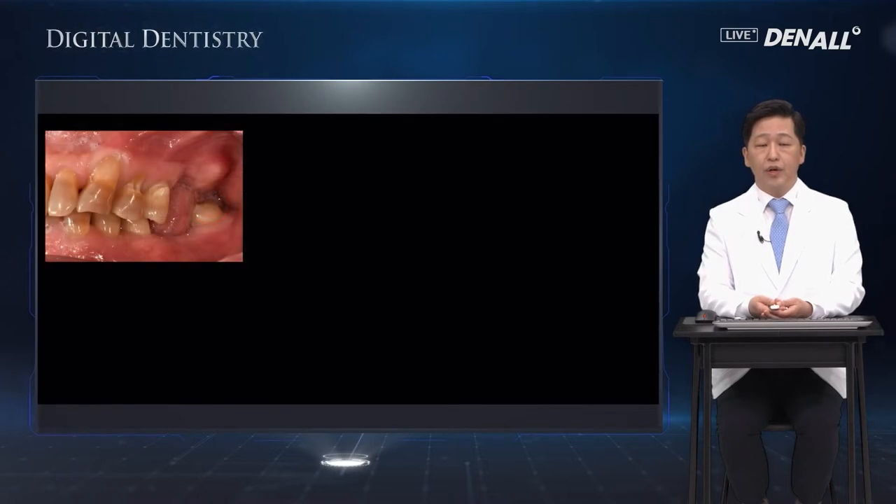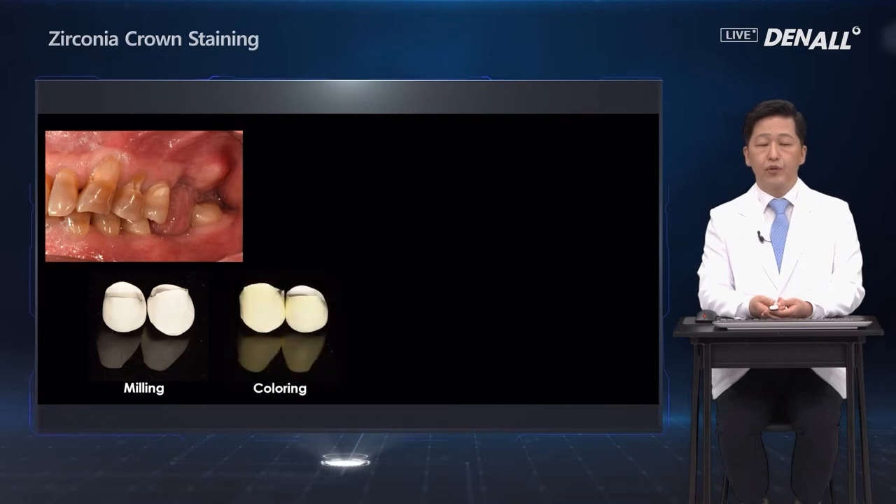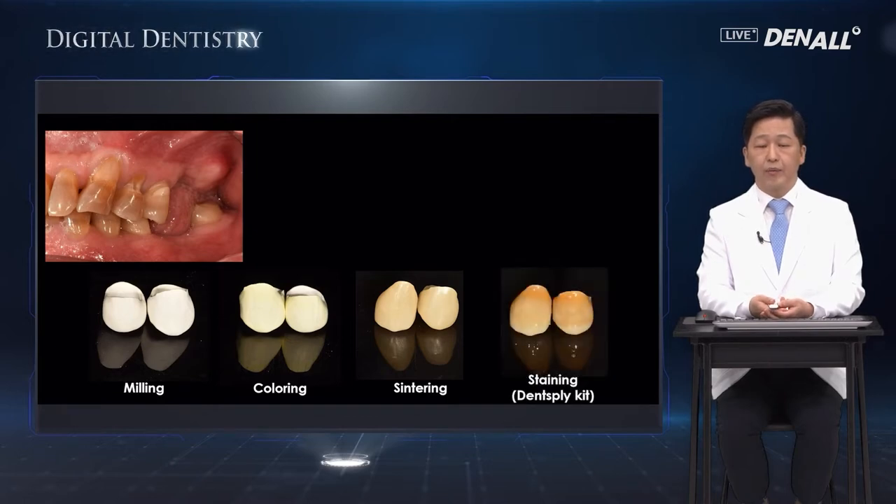Before the procedure, you can see a very unique color of the teeth. After milling, coloring is done before sintering. After sintering, it looks like this — this is far from the color of the natural teeth of the patient. The coloring and sintering is not good enough in this case. Therefore, the Dentsply kit is used to do the staining after sintering.